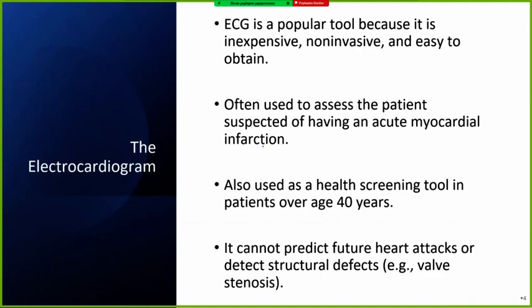So ECG is a popular tool because it's inexpensive, non-invasive, and very easy to obtain. The electrocardiogram is often used to assess patients suspected of myocardial infarction, or heart attack. It is also used as a health screening tool in patients over the age of 40 years.